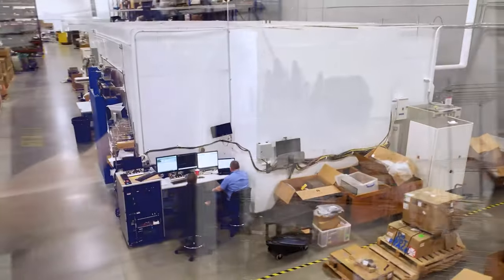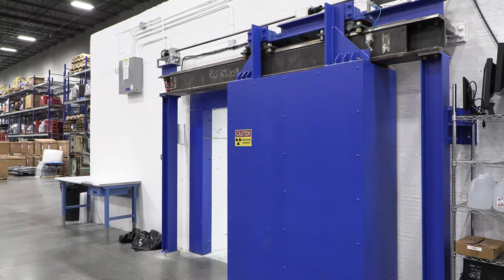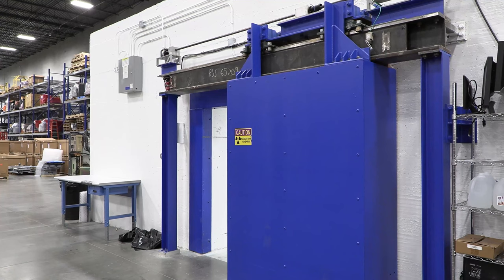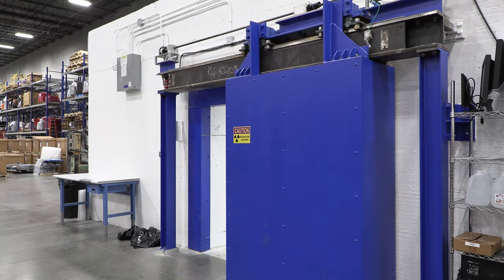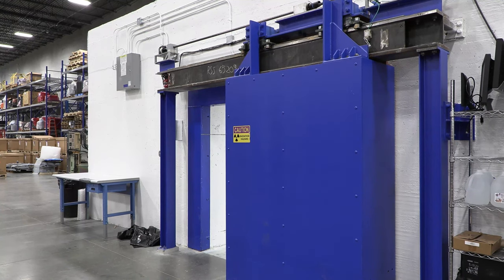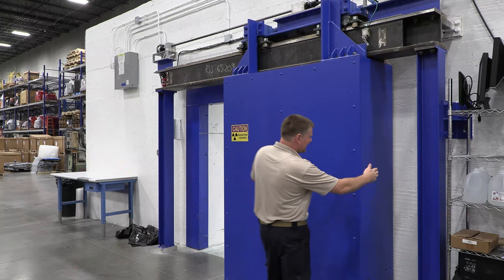So this is a bunker. That's this giant cement structure. It's not the back of the building, guys. How thick are those walls? They're four feet thick, top, bottom, and sides. They handle about 23 million electron volts. Holy cow. And look at it for scale.